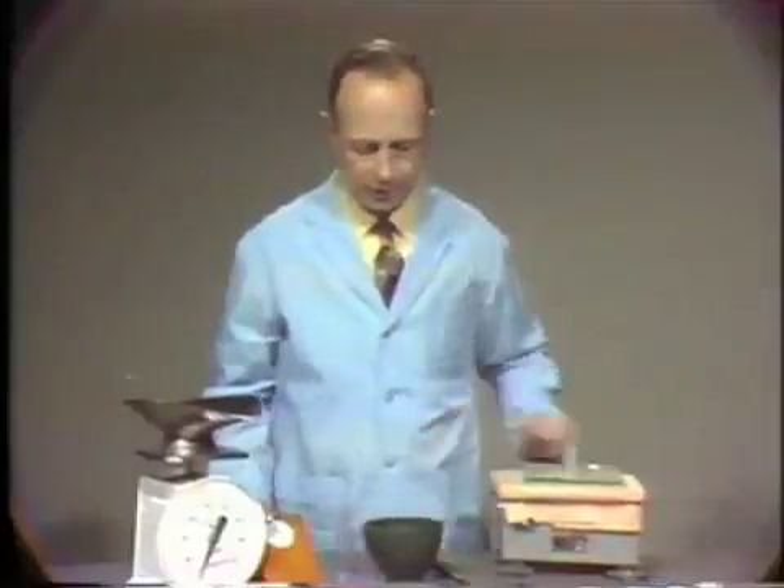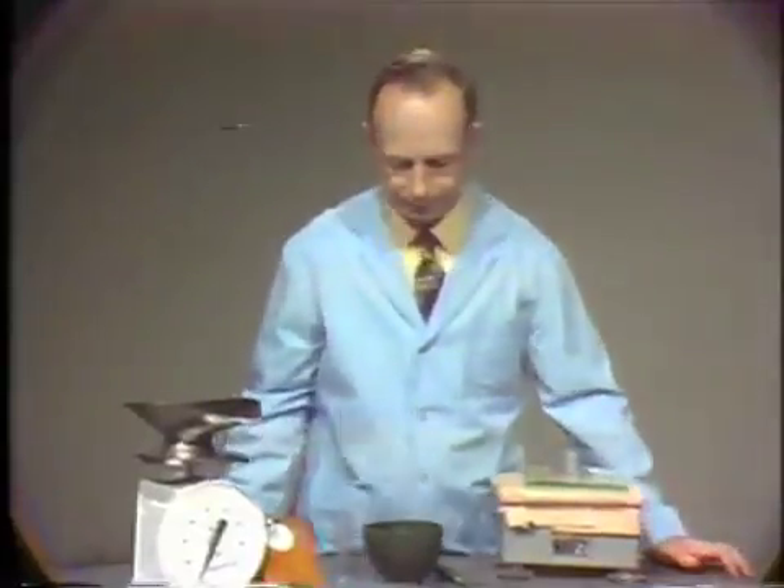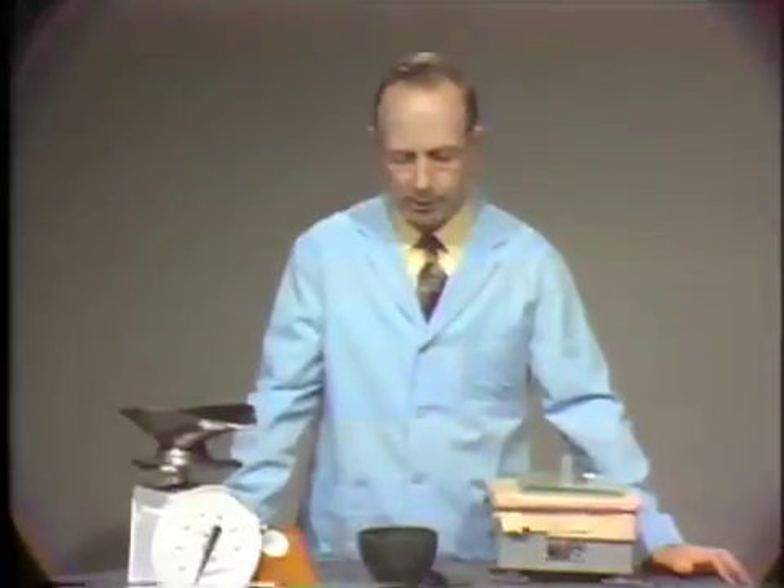We will mix this material for one minute, at which time we will place it in a metal ring, allow it to stand for one minute more, and at two minutes from the start of the mix, we will remove the ring and we will get an idea of the consistency by the slump of the material as the ring is removed.